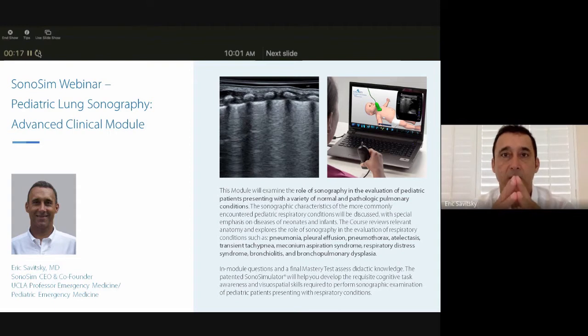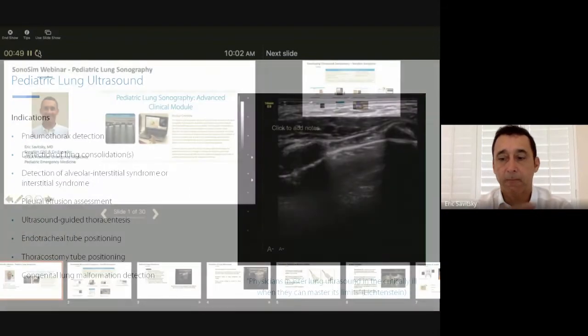So here to talk about pediatric lung sonography. That's the topic we're going to discuss in today's SonoSim webinar, and I'm going to do it over the course of about 20 slides. I'll put the pediatric lung sonography module in context in terms of the broader ecosystem that SonoSim provides, but a majority of the slides, 18 of them, are really going to be focused on pediatric lung sonography, and really talking about the technology, the tools, how you can apply them, and I'm really excited about this. So I'll get into that shortly.